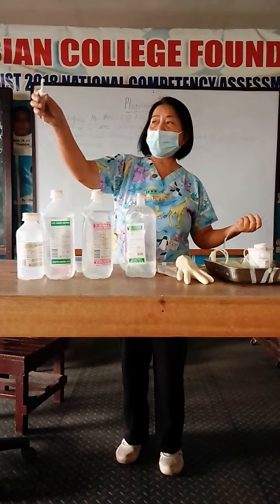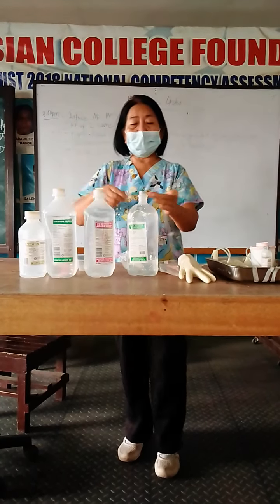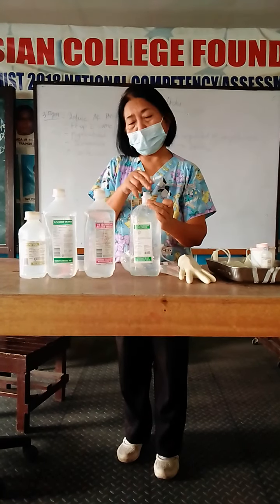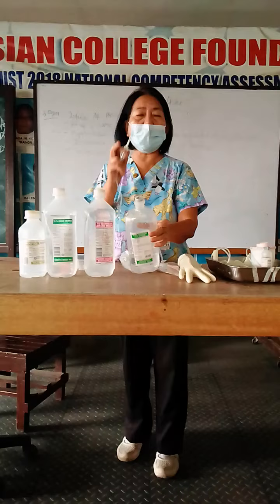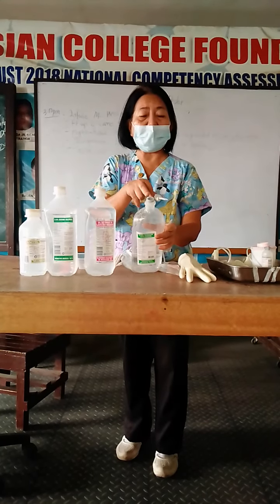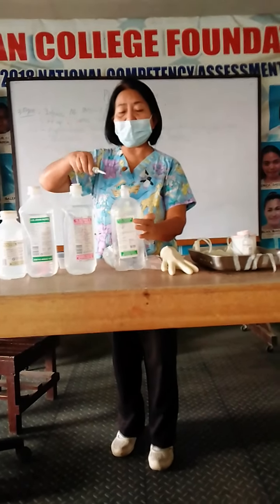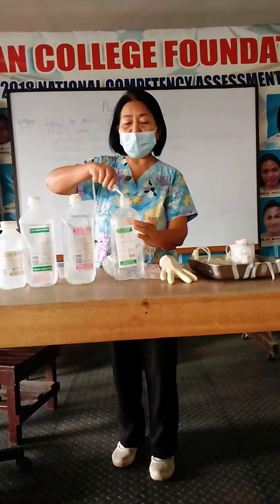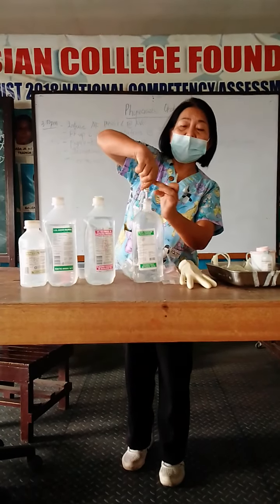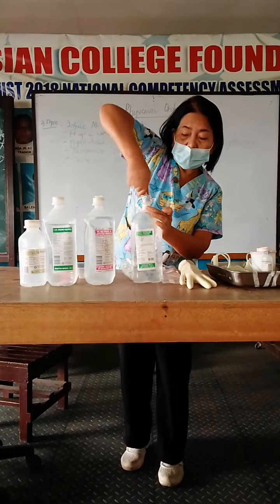Now the sterile set. Hold the hard part or the wings of the Venoclysis. Then you look for the hole. There's a hole here which is bigger and two that are smaller. The smaller holes are where we're going to inject the drug to be incorporated. But the bigger hole is where we're going to spike it. In spiking, you have to look for a hard, stable surface, then you twist. I did not hold it here, but rather at the hard part. Twist down.